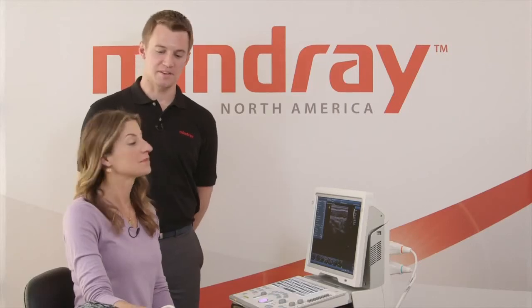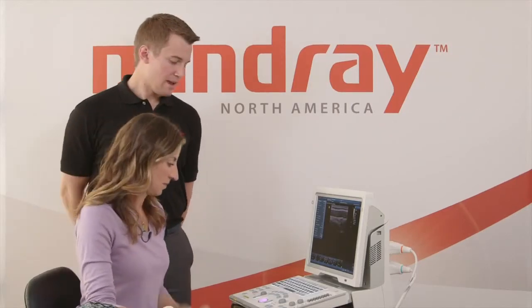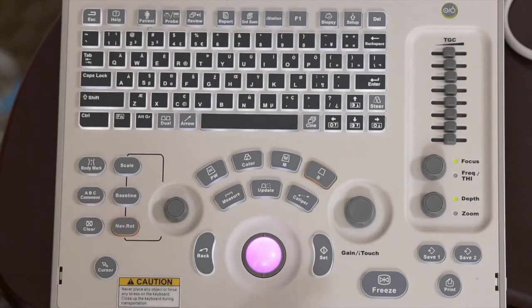In this section, we're going to talk about measuring. When you look at the keyboard, you'll see that there's a measure option versus a caliper option. The measure option is going to be very important depending on which exam preset that you're in.